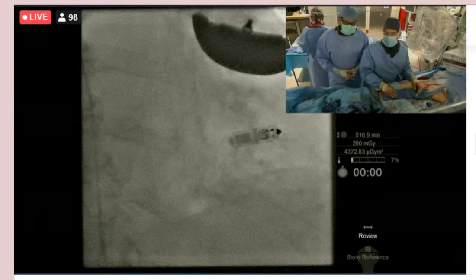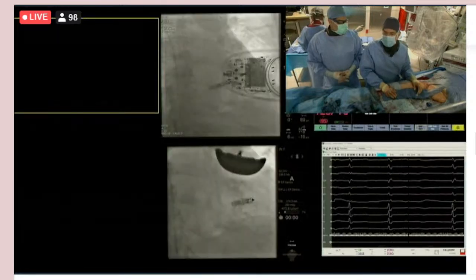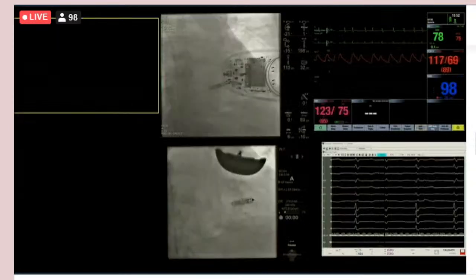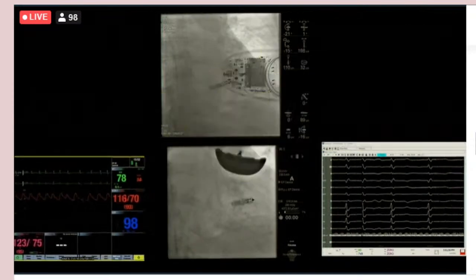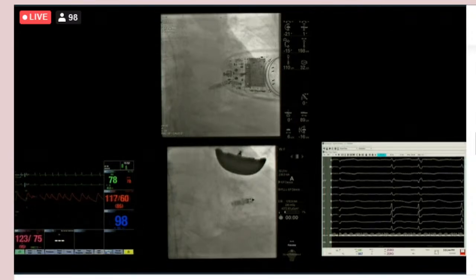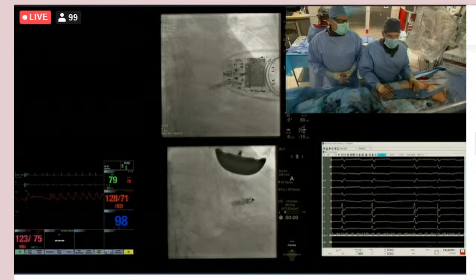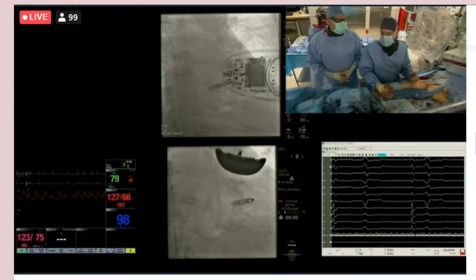So you use that as a surrogate for putting in an A line. That is a $250 arterial line that I use for these cases, because you're going to see a pressure drop on that thing before the non-invasive picks it up. What you're referring to is that red A-line looking thing, which is essentially a non-invasive A-line. Very nice. And when it goes flat, it actually gives the finger a rest.